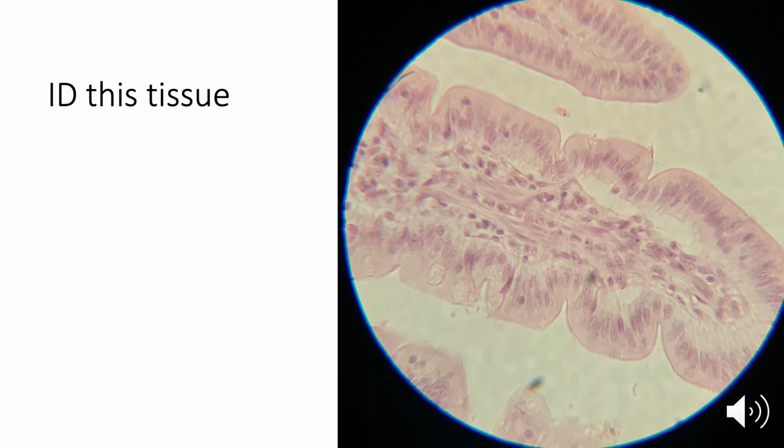All right, our next tissue type, we see an apical surface here. Here's my empty space. This must be my apical surface of cells all through here. And if I look at the shape of the cell, it's elongated, it's drawn out, so it is columnar. Looking carefully at the apical surface, although some areas look a little bit fuzzy, I don't see any distinctive hair-like extensions. So there are no cilia on that apical surface. So I know it's columnar and it's non-ciliated.